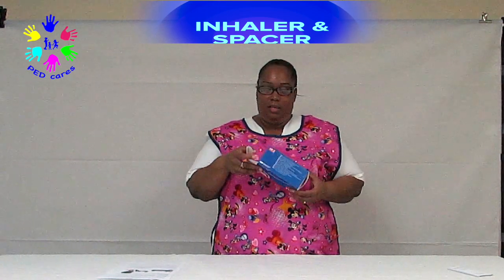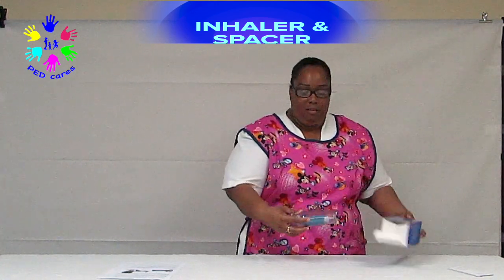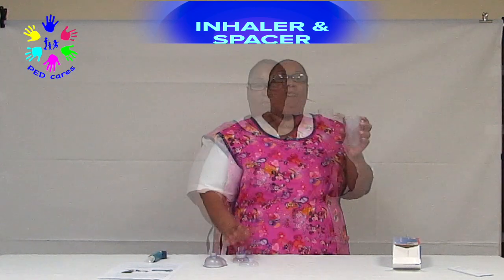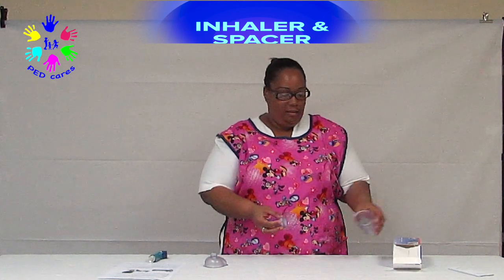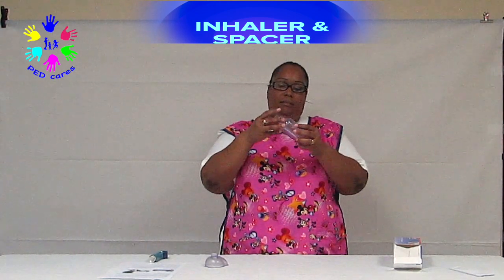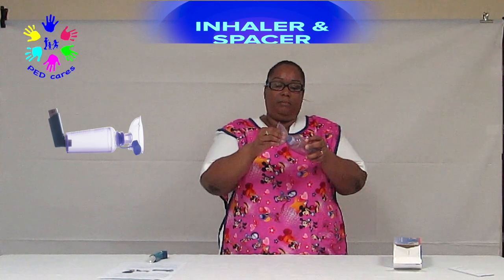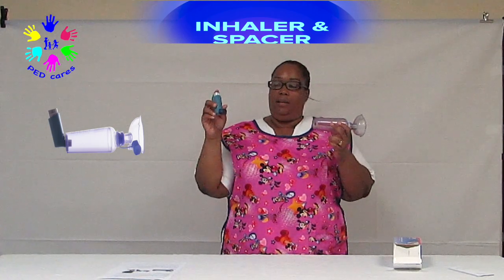So to assemble your inhaler and spacer, you can follow the directions on the box. Otherwise, I want to demonstrate how you do it. I want to demonstrate to you how you would assemble the device. So you will have your device, it may come unassembled in the box. So first you want to cover the device and using the face mask, you attach it to the end of the cover. The other end will have an opening that is to be used with your inhaler.